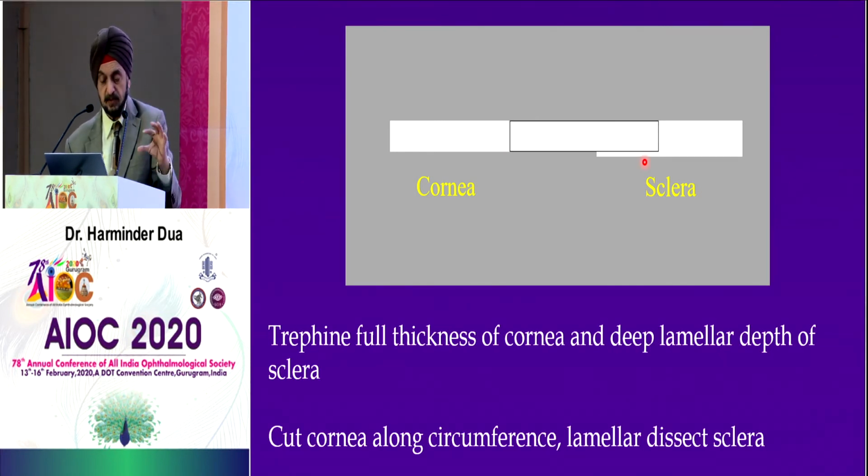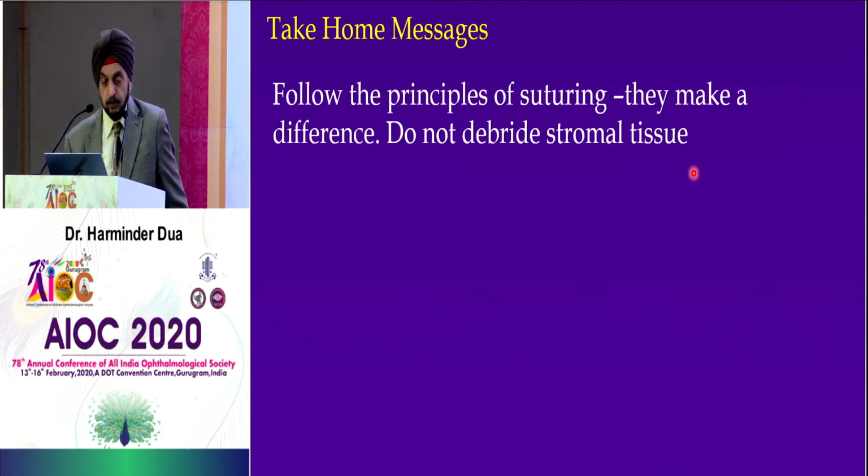And because the sclera is thicker, usually it will fit in and then you stitch it into place. So take home messages: follow the principles of suturing, they make a difference. Do not debride stromal tissue.